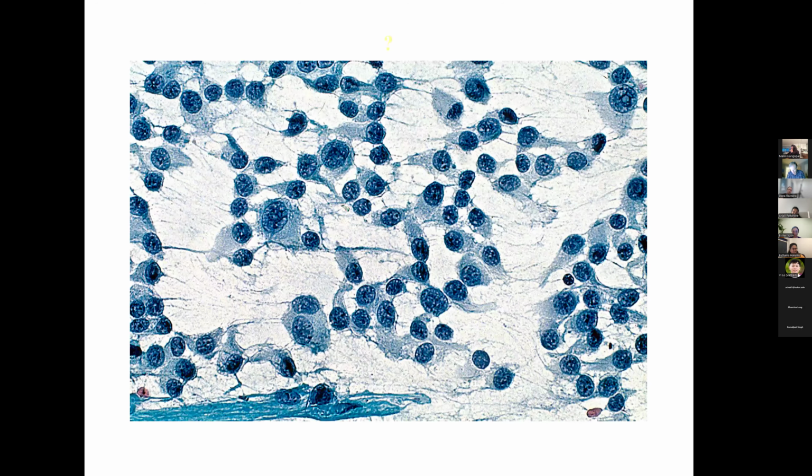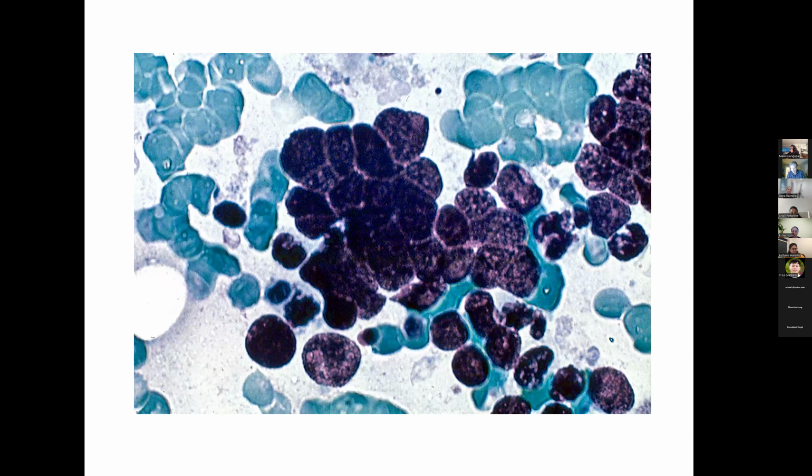So if you want, you can guess what this is. So this looks very plasmacytoid, right? So this patient had a history of melanoma, and we did some stains and proved it was melanoma. Patient had a history of lung cancer, but what is striking here is the presence of this molding and very high N/C ratio cells. So this was a small cell carcinoma of the lung that had metastasized to the breast.